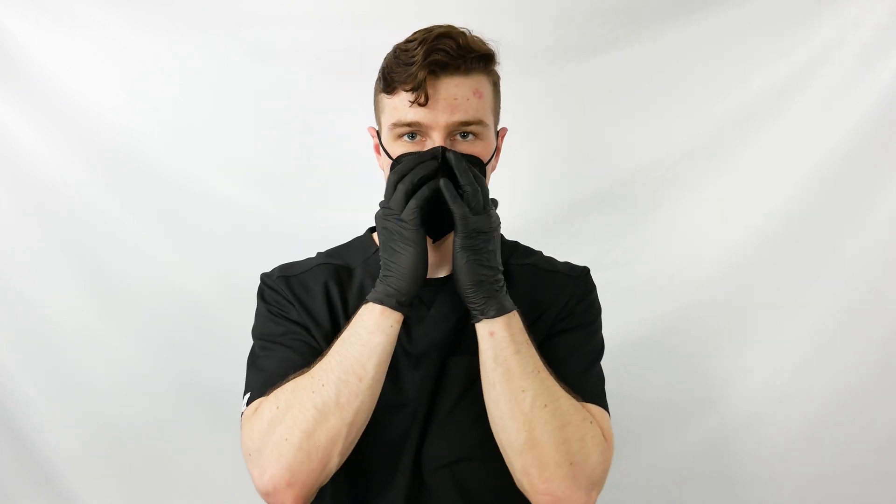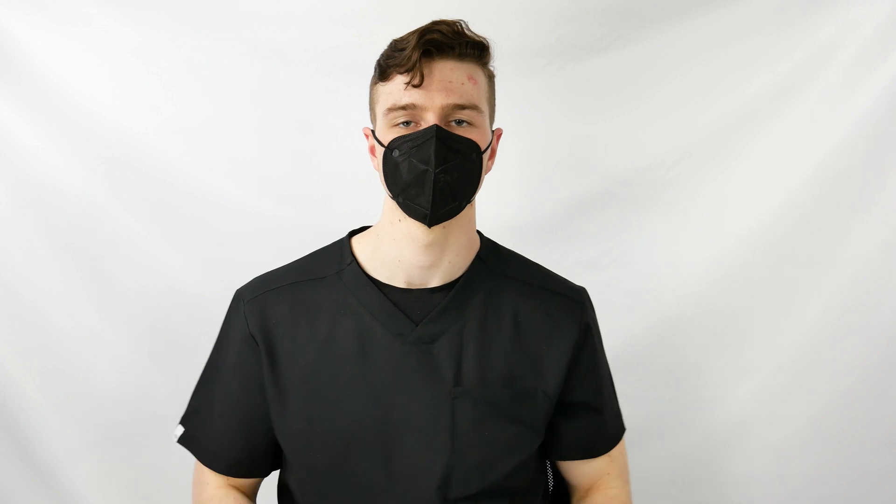Conform the nose piece to your nose. Press with your forefingers against the sides of your nose and cheeks to ensure a tight-fitting seal around your nose.